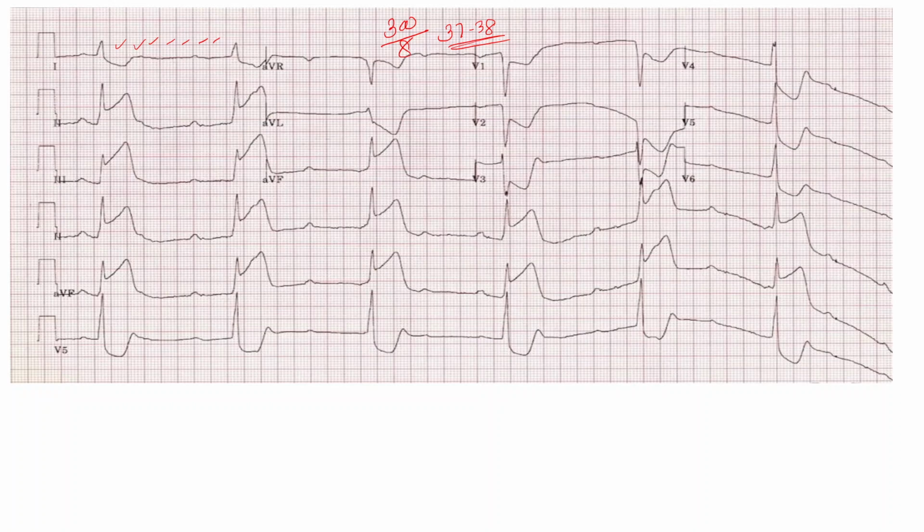And you have to remember one point: whenever the heart rate is around 35 to 40, most of the time the diagnosis will be complete heart block or third degree AV block. Now I have not discussed AV block, so this might be a little bit difficult for you to understand, but I'll be discussing it later anyway. But for now, just remember that in case of complete heart block, when there is complete AV dissociation, the heart rate will be around 35 to 40. So anytime you get an ECG showing a heart rate of around 35 to 40, most of the time there is third degree heart block.